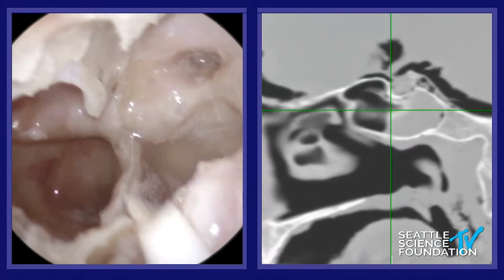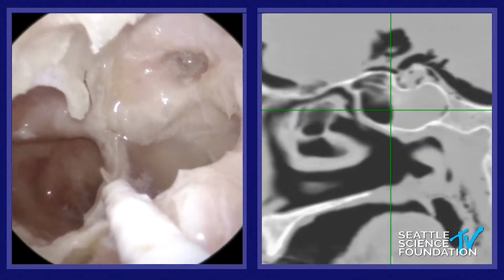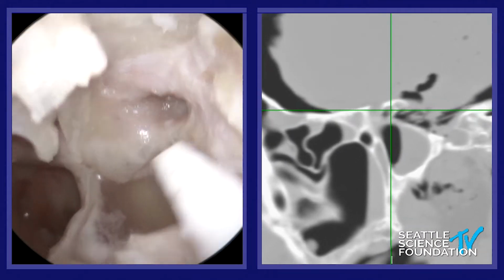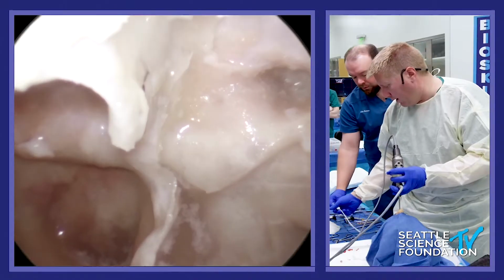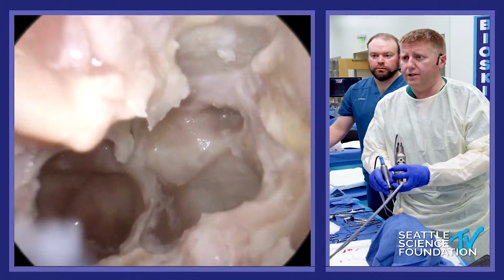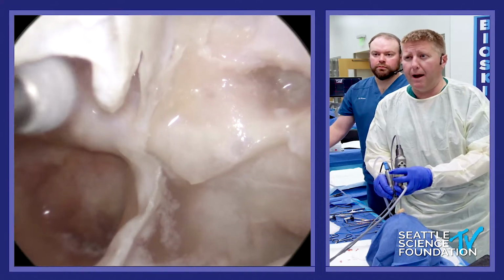So again, here we've got our sphenoid sinus. This is our right sphenoid, our left sphenoid, our sphenoid septum, optic nerve, carotid artery, opticocarotid recess, sella. So it's at this point where it's a little bit of, who's going to do this part? Obviously, you have mucosa overlying this area. We usually try and burn that with a bipolar. We talked about bipolars some.